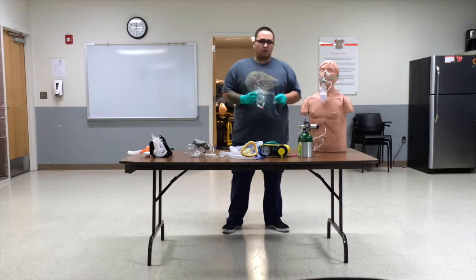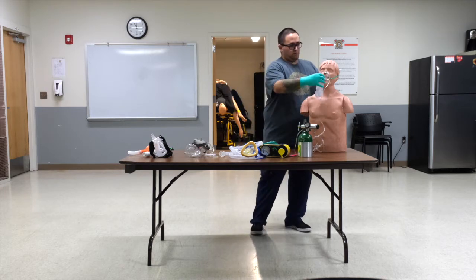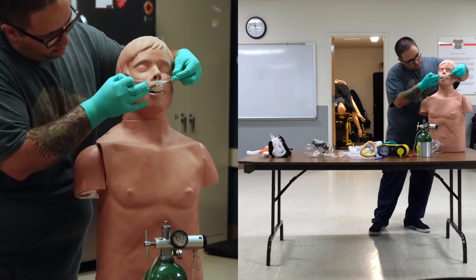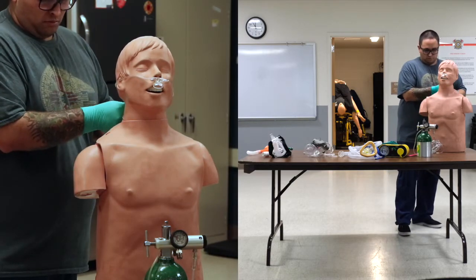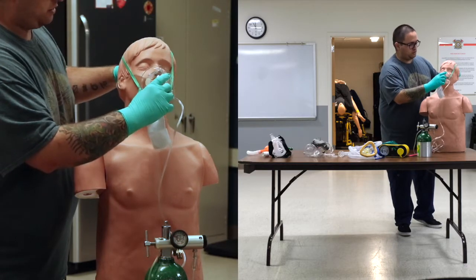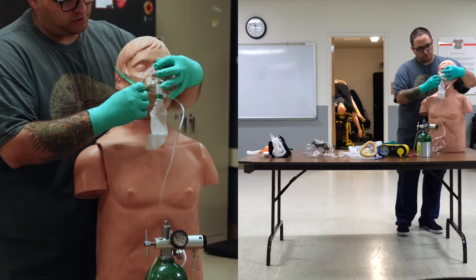It will also be a good time to add your end-tidal CO2, which for this guy, because he does not have ears, we're just kind of securing for that. We also want to get a good SAMPLE history from family or the patient, making sure we're getting a good medical history as well.